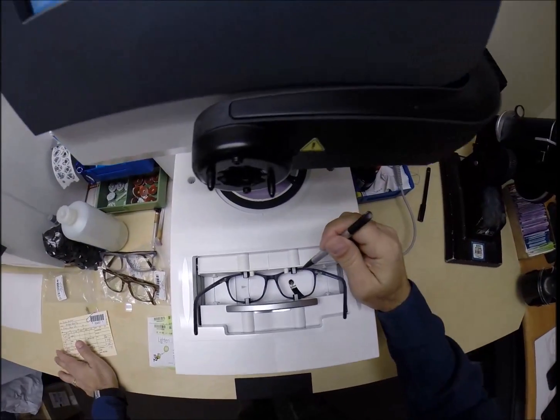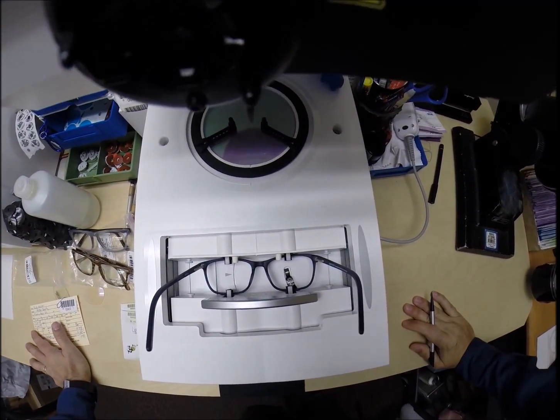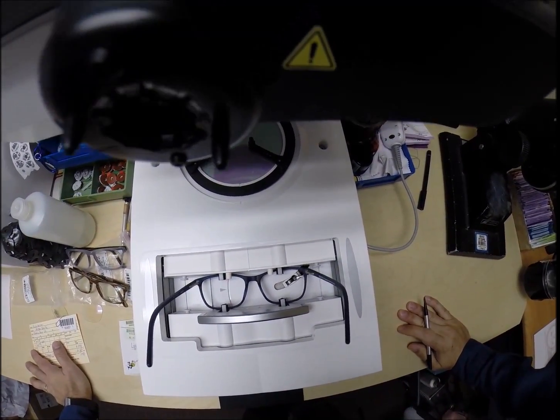A little stylus is going to pop up and go around and trace the inside bevel of the right side of the frame before doing the same thing on the left.